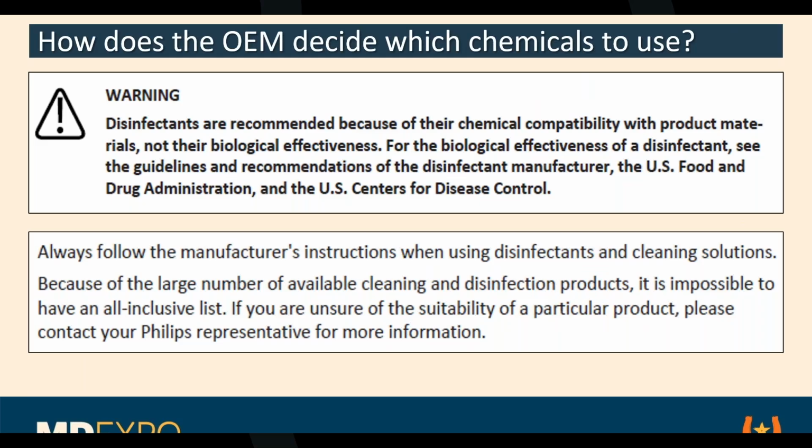And what happened then, it was up to the OEM, because ultrasound was being used during COVID for lung. That was the primary diagnostic tool for looking to see if the lungs were going south, and the treatment had to be ratcheted up dramatically to have any chance of saving the patient. So ultrasound was used, but then the sonographer walks down to central processing and there's nobody home. And I'll show you some examples. And Mark, you've seen some of these too.